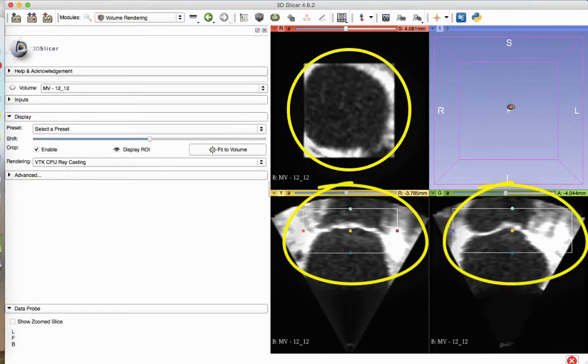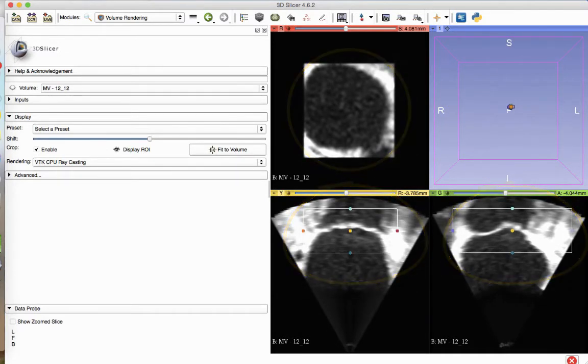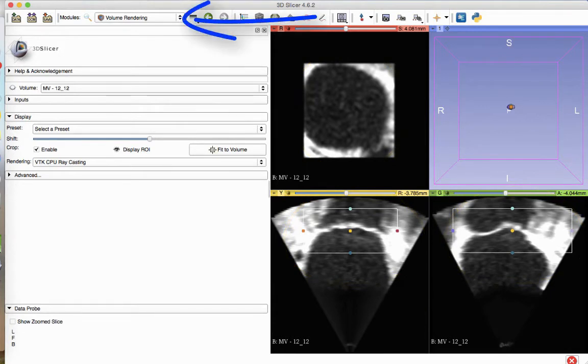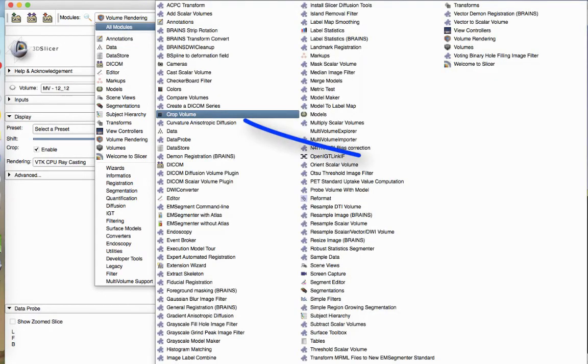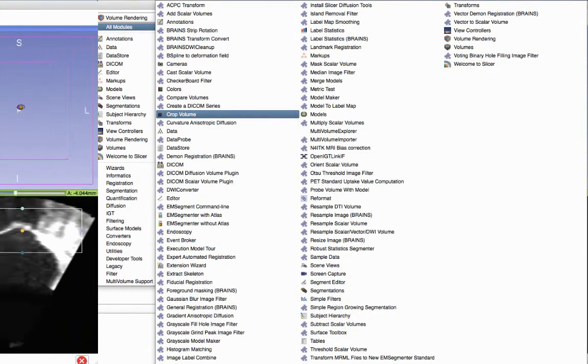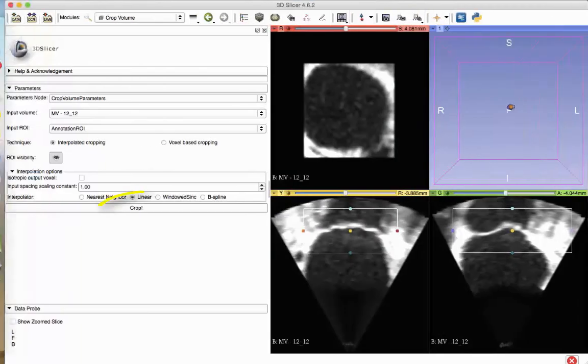After selecting the volume dimensions, enter the Crop Volume module located in the All Modules link. Click the Crop button within the Crop Volume module to remove the volume you no longer wish to be present.